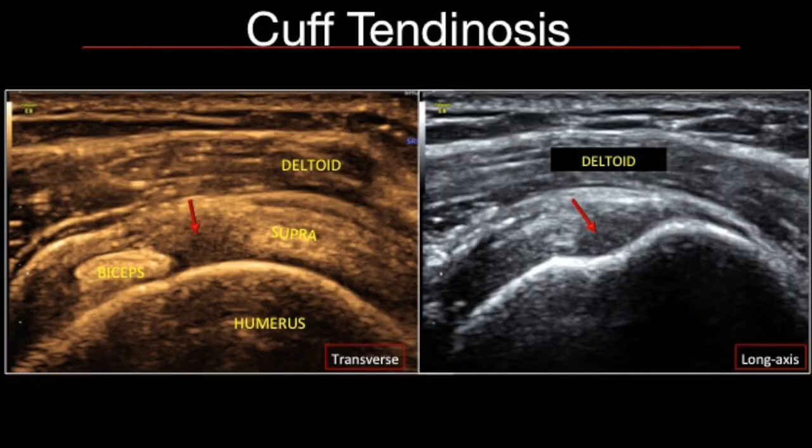In this case, on short axis we see thickened anterior fibers of the supraspinatus tendon with an ill-defined hypoechoic appearance of the anterior edge. On the long axis, the normal fibrillary pattern is lost and there is some cortical irregularity over the greater tuberosity. However, there is no obvious tear to be seen.